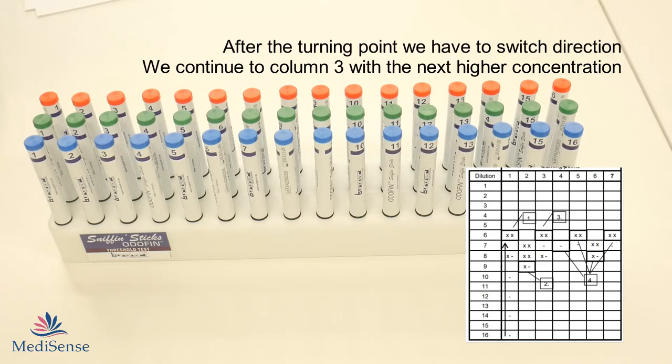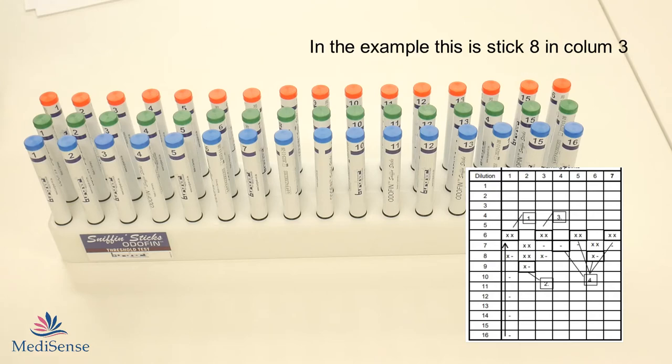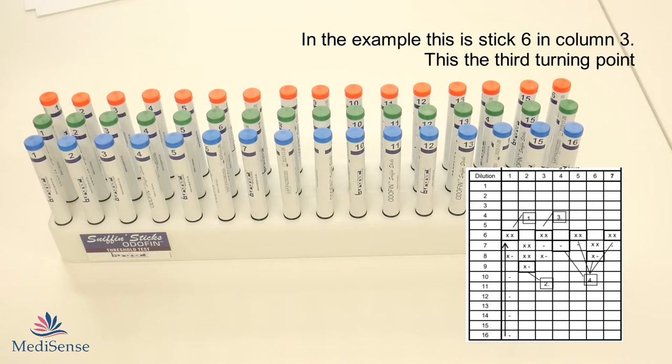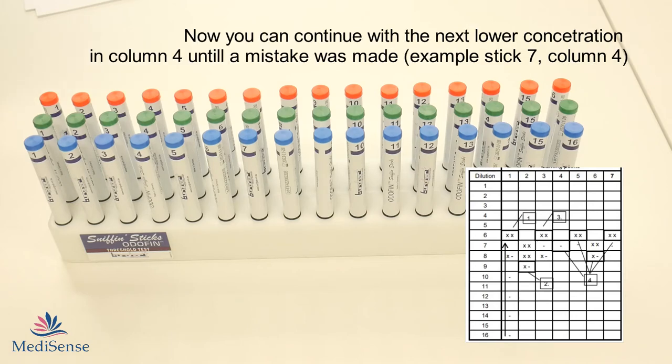That is the second turning point and then you continue to the third row. Now you go up to the next higher concentration. So not 9 but 8. You continue until the test person identifies the sticks twice in a row.